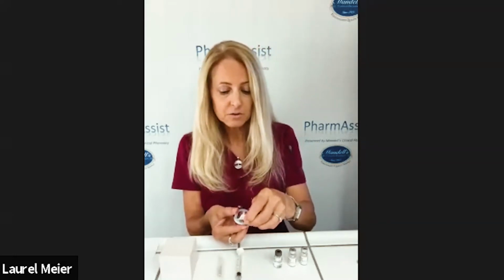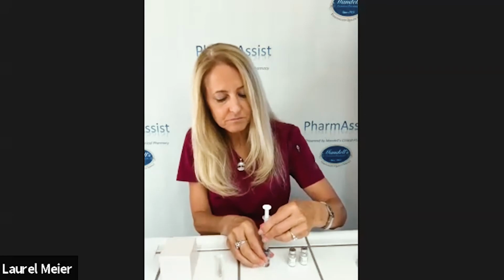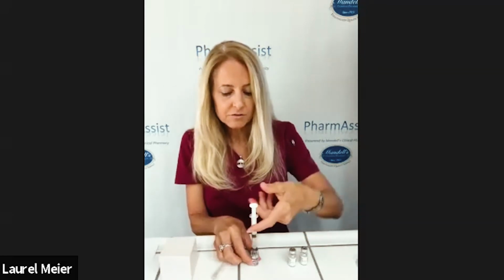So the next thing we're going to do is to peel that off. The Q-cap will go directly on the liquid. Just pop it on and take the plastic covering off so it looks like this. Then you're going to take your 3 ml syringe and put 1 milliliter of air in the syringe and twist it onto the Q-cap. Now, keeping it on a hard surface, you're going to push the air in and invert it.